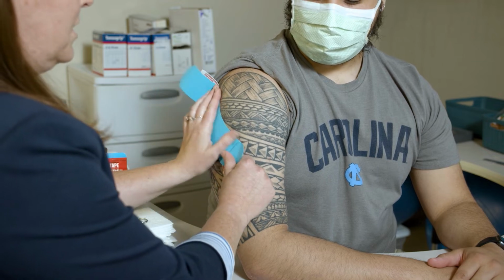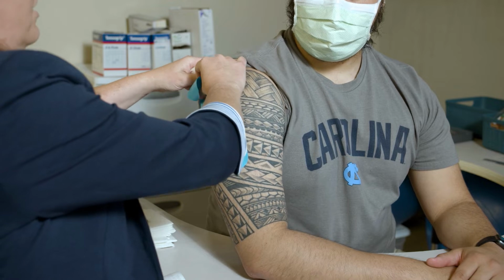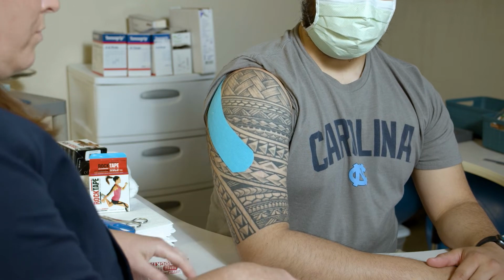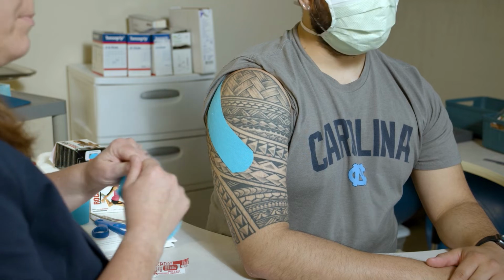So we're going to do 2 pieces of tape. They're going to wrap around. And these tapes you don't tend to pull. So these are called your stabilizing strips. You don't stretch those, you don't move those. The decompression strip, the one you want to pull, it just has a little bit of pull to it.